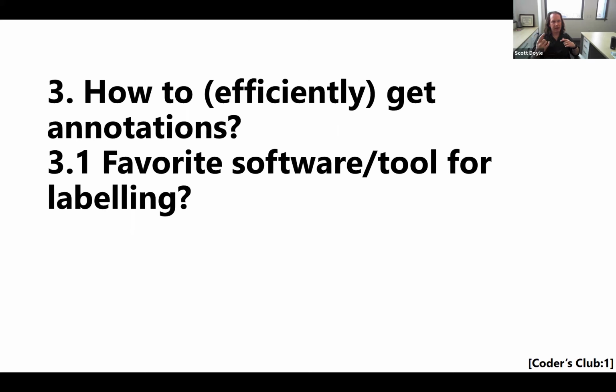So part of that uncertainty or ambiguity about definitions of classes comes into our development of the classifier. And that's why I advocate that one of the first conversations you need to have is with your doctors, and sit them down and talk to them about this. And continue to talk to them and have these in-depth discussions as you get version 1, version 2 of your classifier running, so that you can talk about how to efficiently annotate.